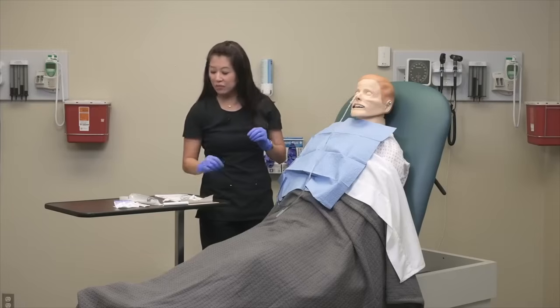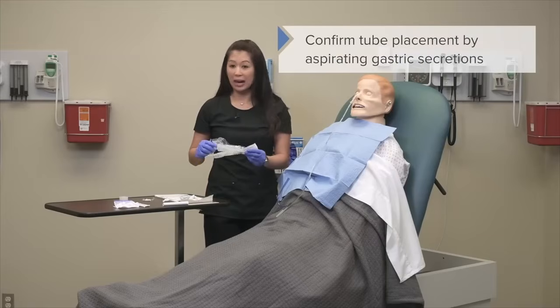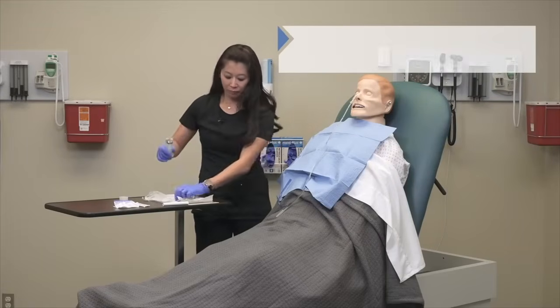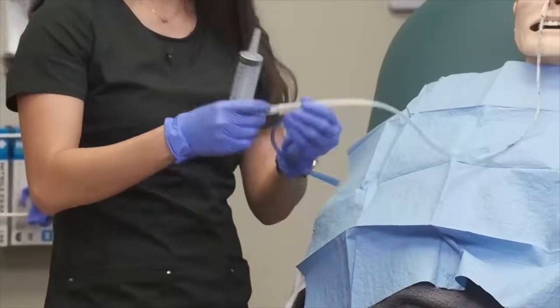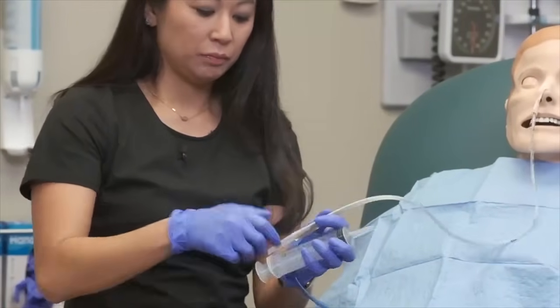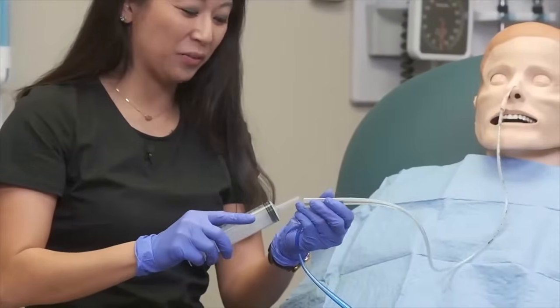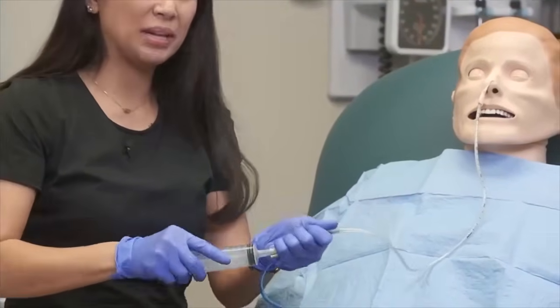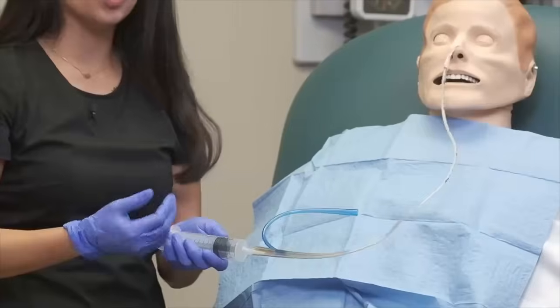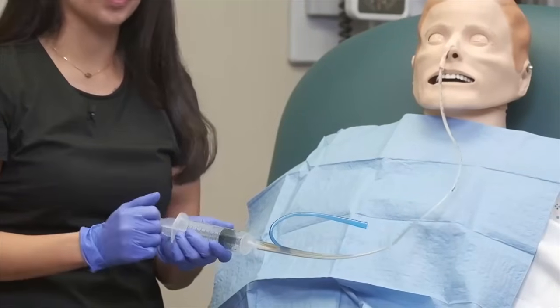Okay, so now that I've done this, the next thing I can do is check for gastric contents and make sure it's in the right place. So when I do this, I'm going to take off my filter. Now your hands may be a little slippery from the lubricant. I'm going to insert my piston syringe, and then you can pull back, and if it's in the correct placement, you're going to see gastric contents come through here.